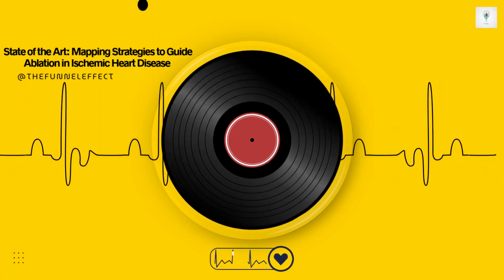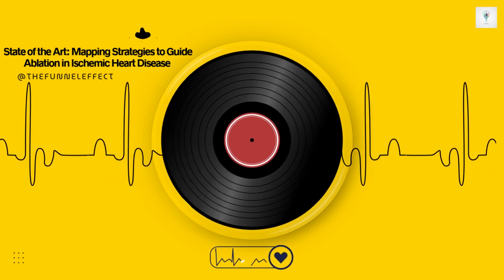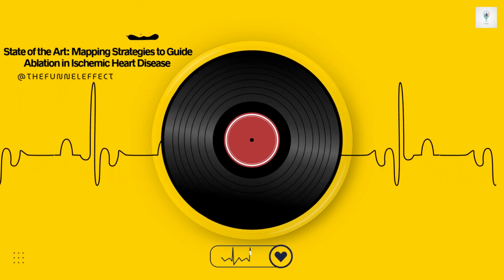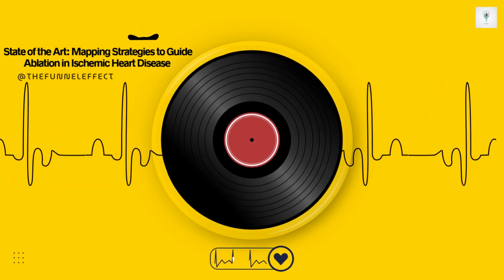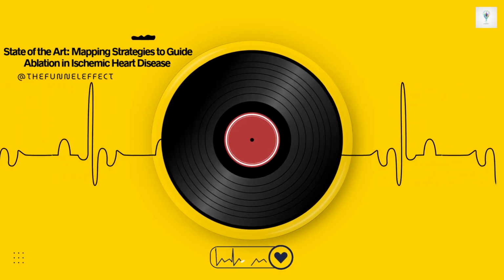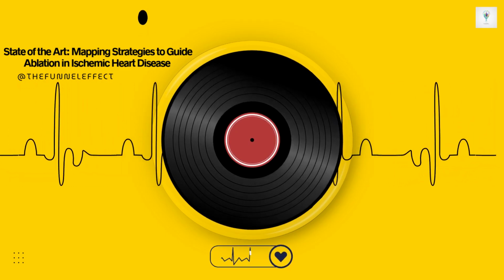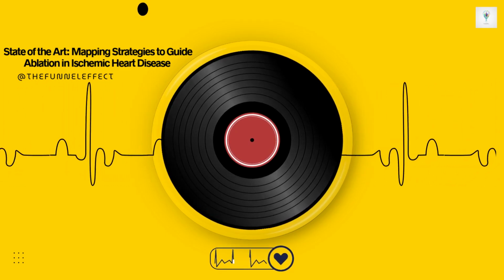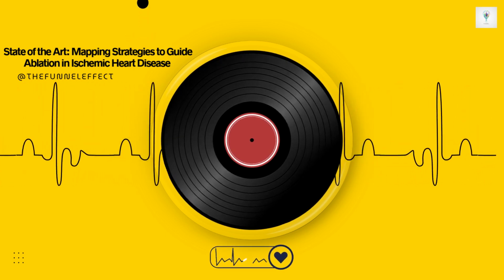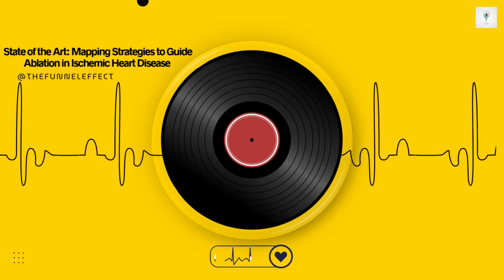Exactly. They represent electrical energy that's still slowly crawling through parts of the scar after the rest of the ventricle has already recovered. They sound like a prime target then. If you get rid of the late potentials, does that mean you've fixed the slow conduction? Getting rid of LPs is definitely a good sign. It's a strong predictor of success. One study by Silberbauer, for example, found much lower VT recurrence, around 16%, if they managed to abolish all the LPs, compared to nearly 50% recurrence if LPs persisted after ablation. That's a big difference. It is.